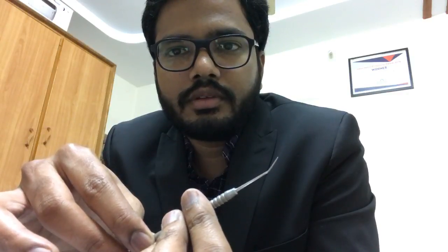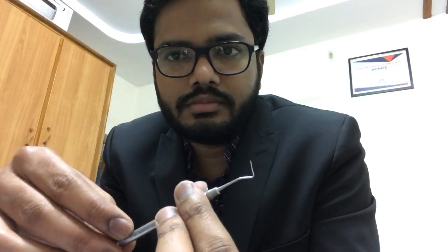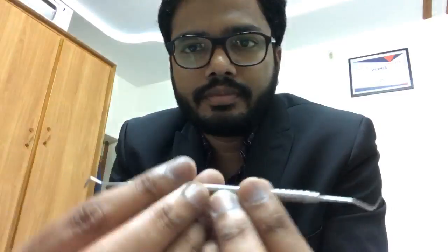So Wards carver, double end instrument, one end, and this is the other end, right? And then you have Hollenbeck. Yeah, it's true. Okay. Fine. I'm sorry for the sounds, okay.